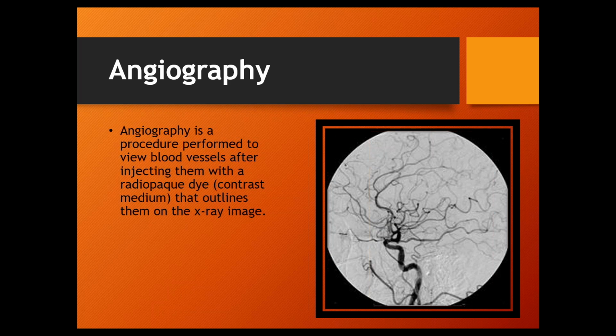Now, everything I just described, this probably isn't the best first image to show up, because that scenario I just described to you was a radiographic image, which means that your typical lay on the table, X-rays through the body, shows an image. This is actually a fluoroscopic image, which is a little different. That's why the background is white and the blood vessels are actually dark. It's the same exact concept, just in reverse.